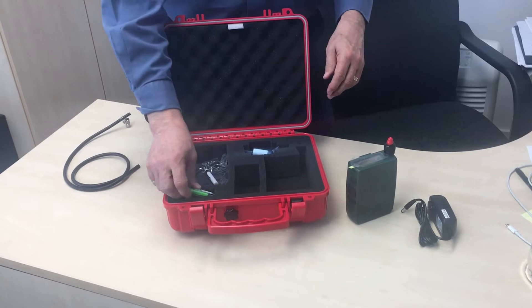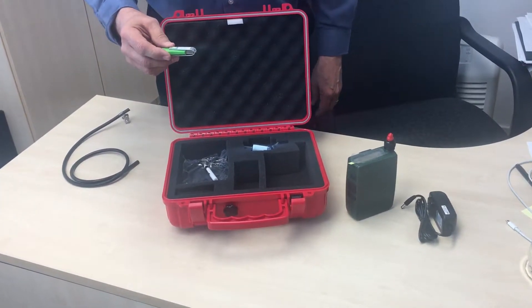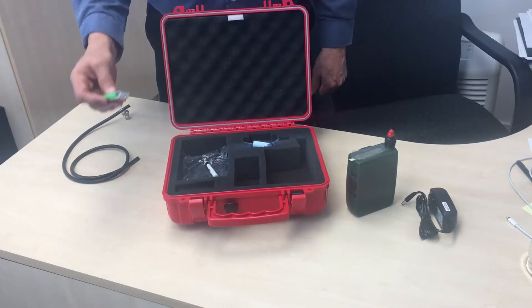Next, all the software loads on a memory stick, which can be loaded onto your PC or Mac to control the unit.